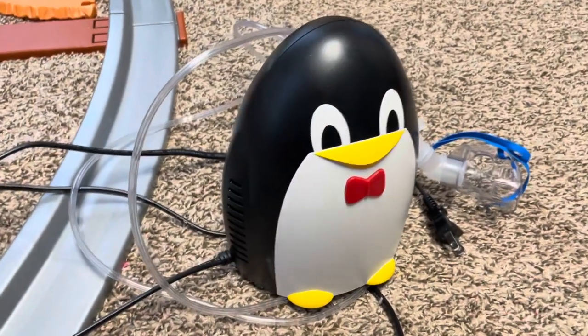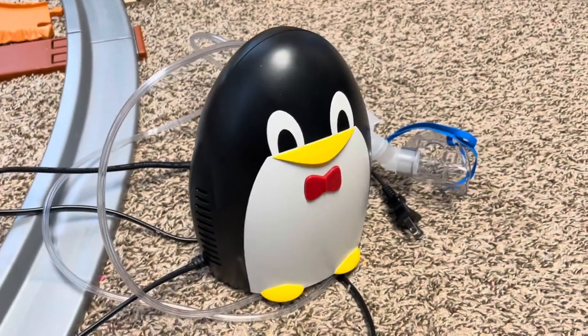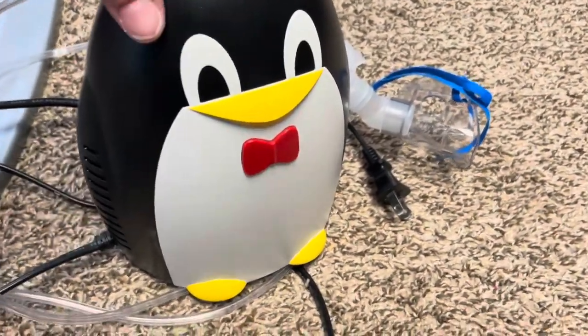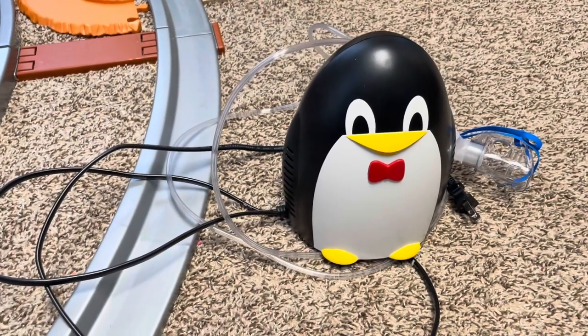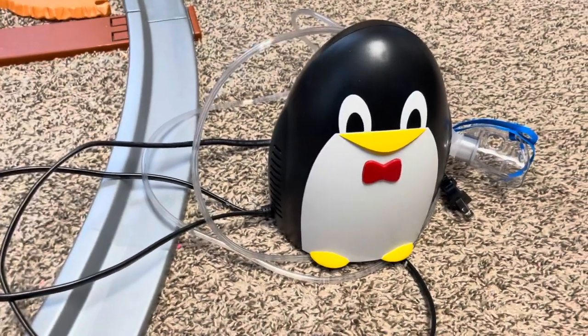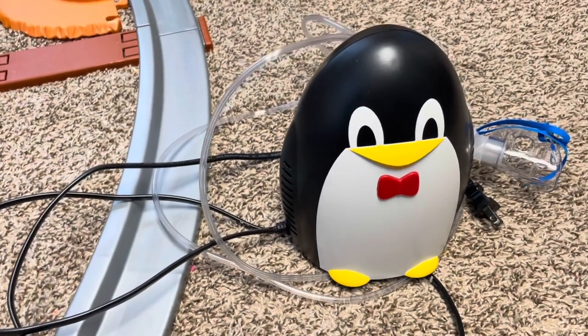Also, this can come with a super cute igloo case that looks like little ice blocks — it is so cute. I did have it at one point but I have no idea where it went. I think you can get the nebulizer with or without the case, and otherwise you can just buy your own case.